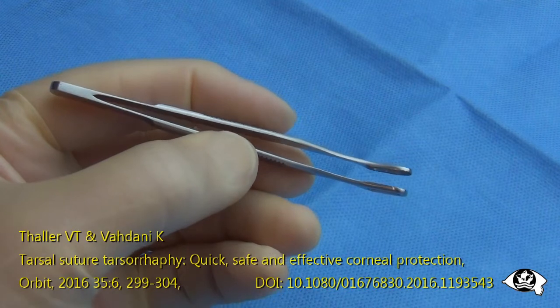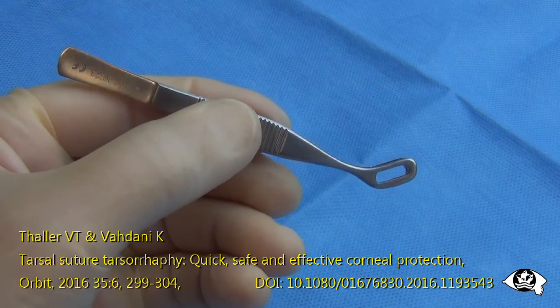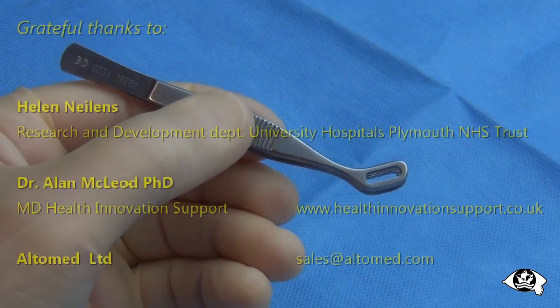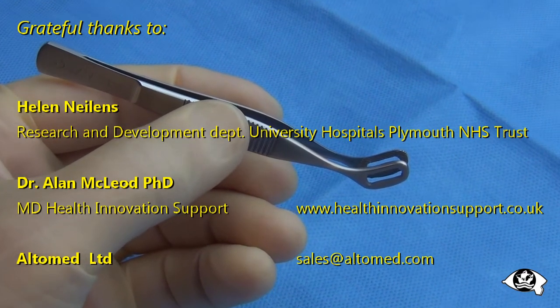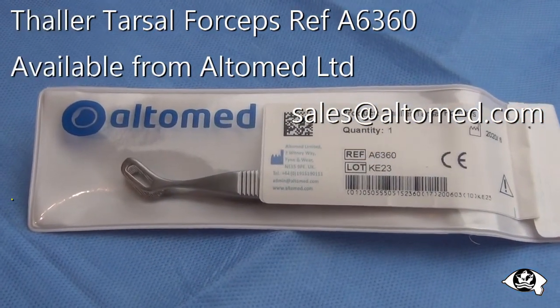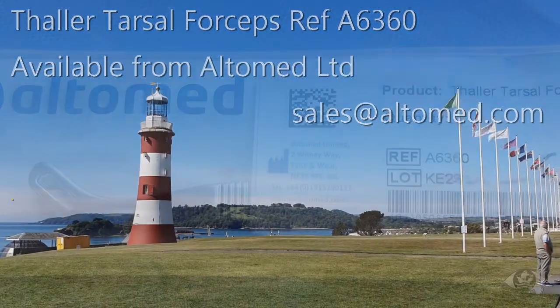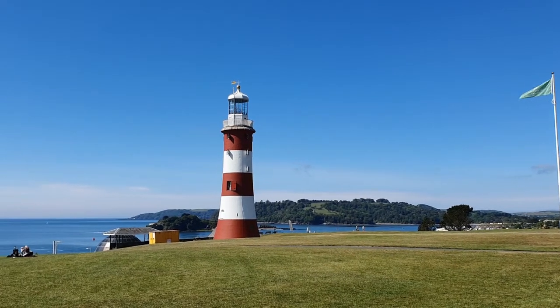To summarise: tarsal forceps make the accurate placement of sutures within the tarsal plate easy by atraumatically holding the lid margin flat while the suture is inserted. They are ideal for use in ophthalmic urgent care departments when prompt corneal protection is required. They can be similarly useful in ophthalmic, maxillofacial, or neurosurgical theatres when protective eyelid closure is needed.